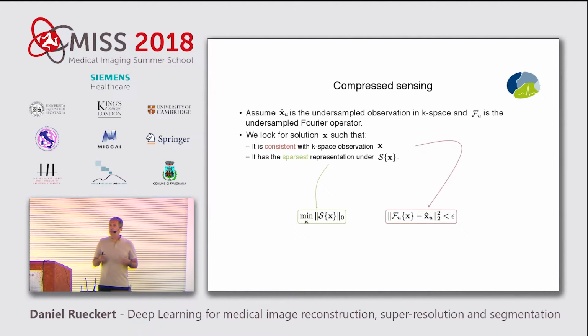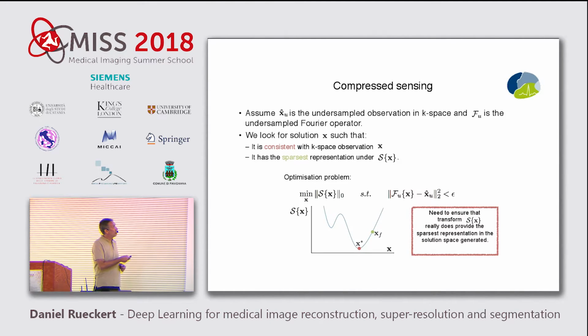It turns out, though, that it's not quite as optimal as you can make it. And the reason for this is that this sparsity transformation which I'm using, I have to specify a priori. So basically, it's a user choice. You as a user decide, actually, you know what, I'm going to use this particular wavelet transform. But that might not be the optimal sparsifying transformation for your data.